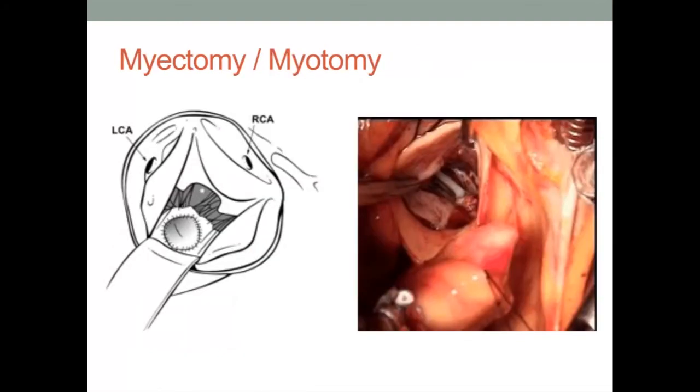In instances where preoperative evaluation has also revealed subaortic narrowing or obstruction, a concomitant myotomy or myectomy, in addition to aortic valve replacement, may be an option for an anatomically and physiologically adequate left ventricular outflow tract. Exposure is obtained as previously described by either an aortotomy or by a complete transection of the ascending aorta. The coronary artery ostia are then well defined to avoid any iatrogenic injury. In addition, the valve leaflets, commissures, and area of the presumed conduction system are also well identified and protected during the process of myectomy or myotomy.